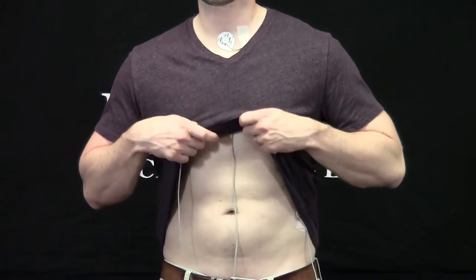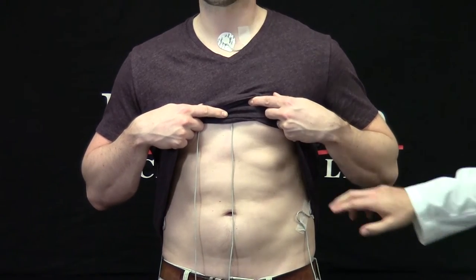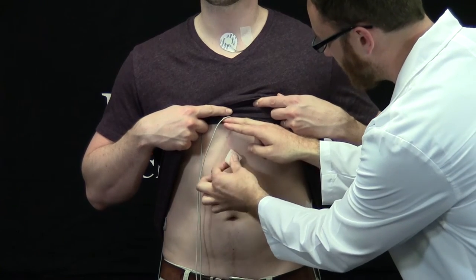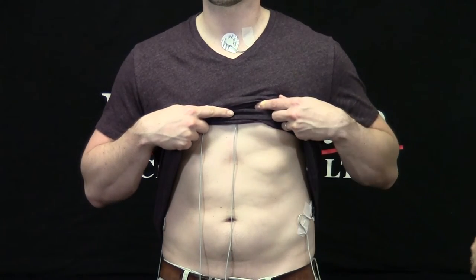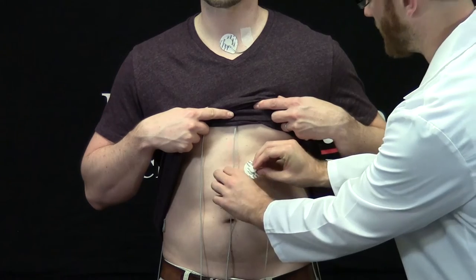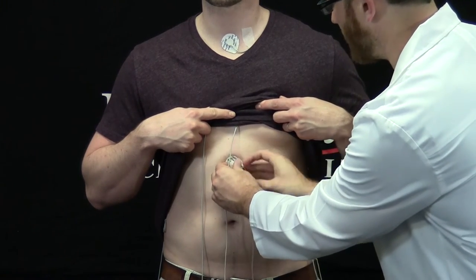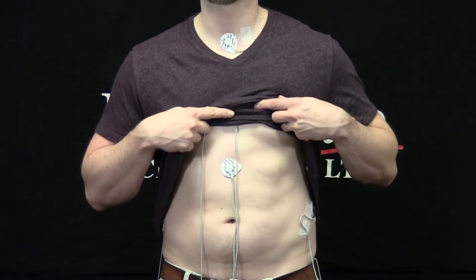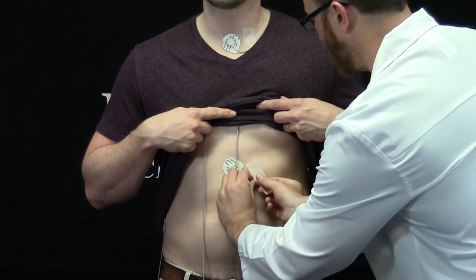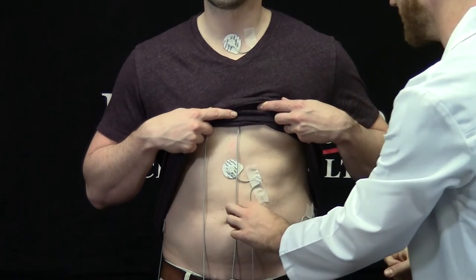The negative sense lead goes just below the sternum on the xiphoid process. I'll ask our subject to lift their shirt above their stomach. I'm going to use my fingers to locate where the ribs come together and clean just below it with the alcohol prep pad. I'm going to take another electrode, again with a white lead wire attached, and place it at the site I've just cleaned. Finally, I'm going to take a piece of micropore tape and make a service loop next to the electrode.